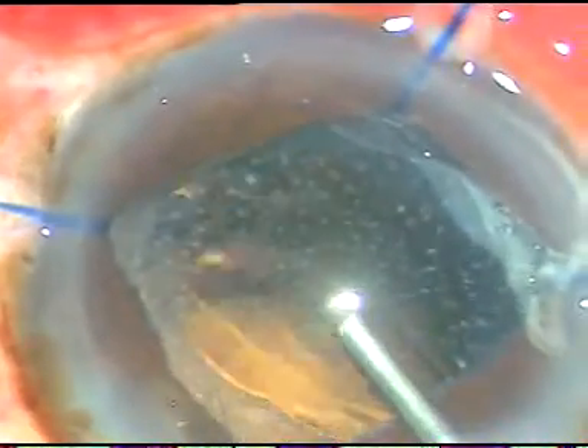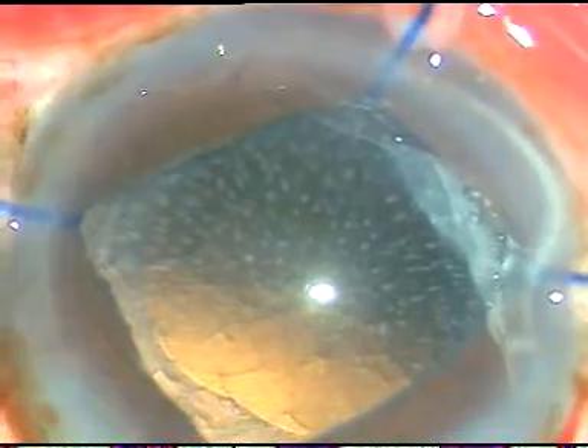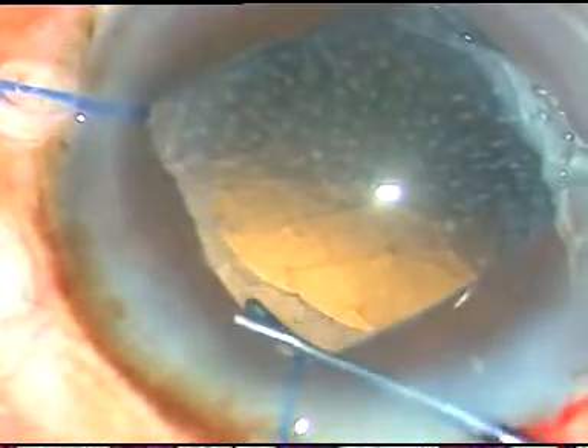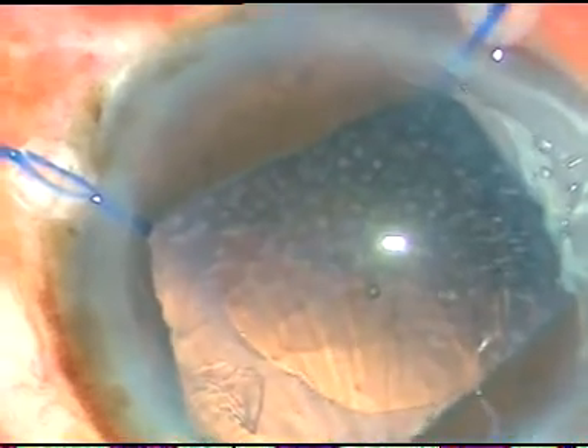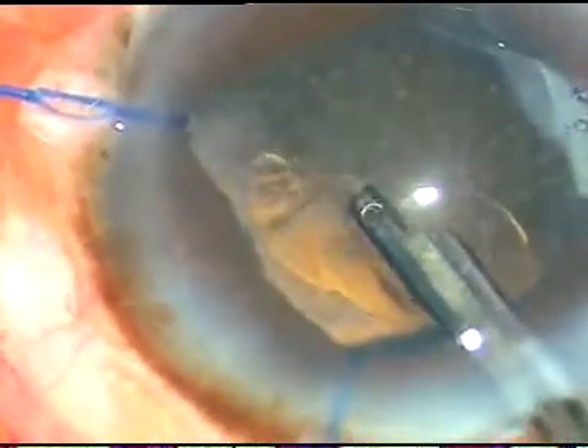The cortical matter is removed. I inject some more viscoelastic substance and can see some cortex at 3 o'clock. The anterior portion of the cortex is showing there, so I have planned to go again with the Simcoe cannula and remove this cortex.